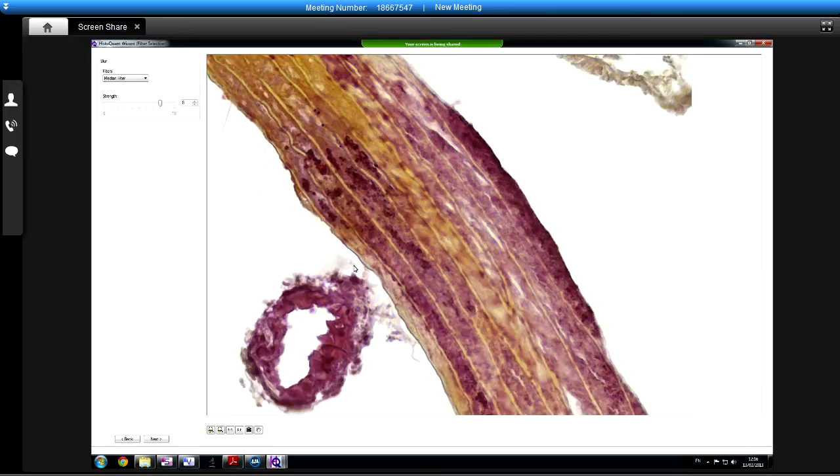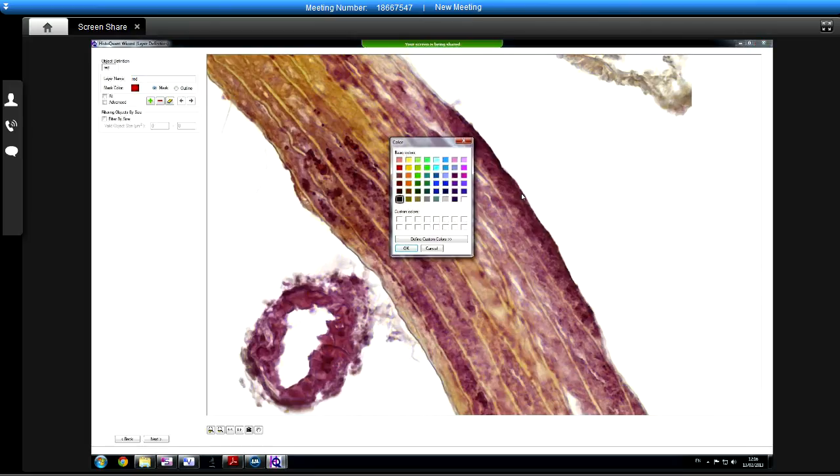I just normally put the pictures. So what would you call the red layer? We'll just call it red if you like. And we'll change the marking colour to something other than red, because it will be difficult to see what's going on otherwise. And let's just start clicking on some of this and seeing what happens. See what happens if we do fill.